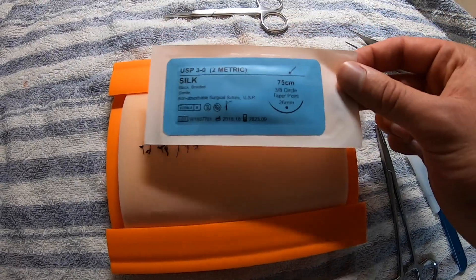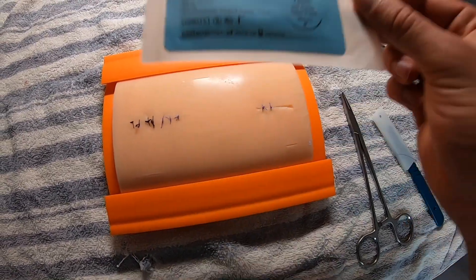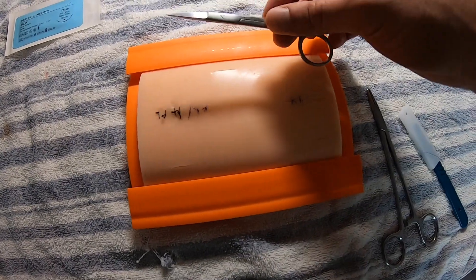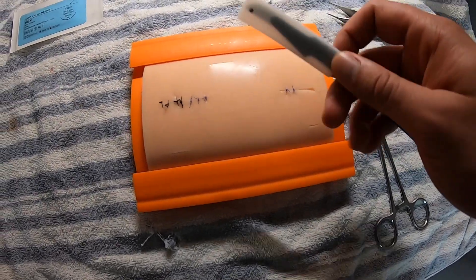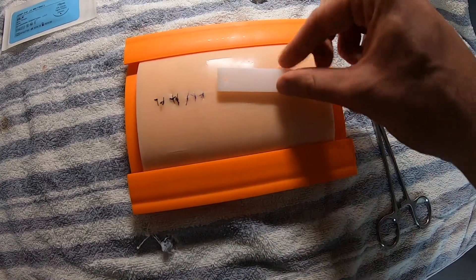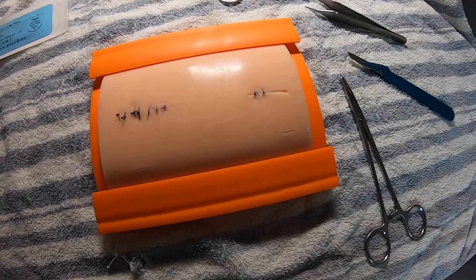Then we have our closed and sterile sutures. A lot of times in medical school you can actually get these from the hospital your school is associated with, because they have an expiry date and when extras expire they'll give them to medical students to practice. Then we have our scissors to trim the excess on the sutures, and finally our scalpel — which is super sharp, surgical. You cut into your wound analog, make whatever incisions you want, horizontal or diagonal, and then you close and practice.